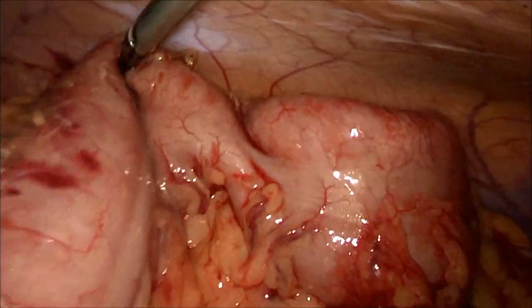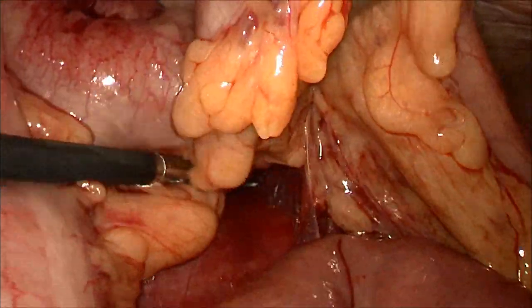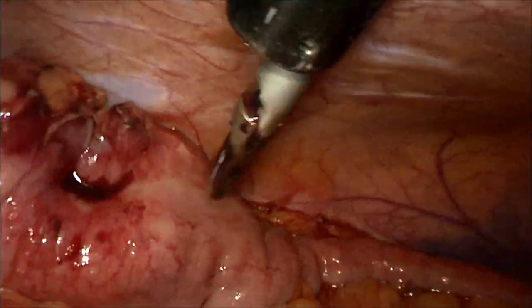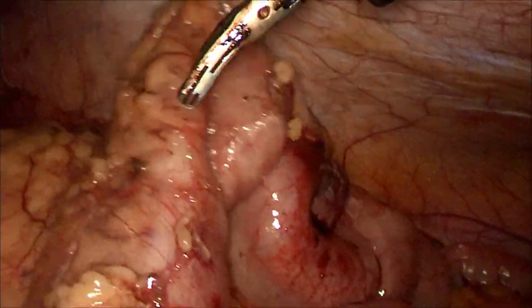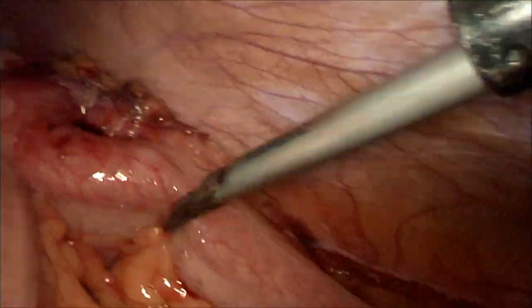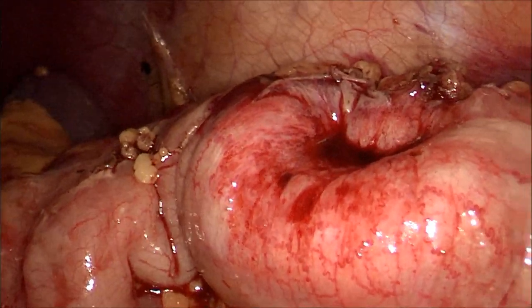The completed left colon mobilization. You can appreciate the tumour at the splenic flexure with the large umbilication on the tumour surface. The specimen is delivered out through a midline wound with a wound protector and a stapled anastomosis is performed extracorporeally. Adequate lateral sigmoid mobilization is very important for this part of the operation so that the distal segment of the colon can be delivered into the abdominal wound.